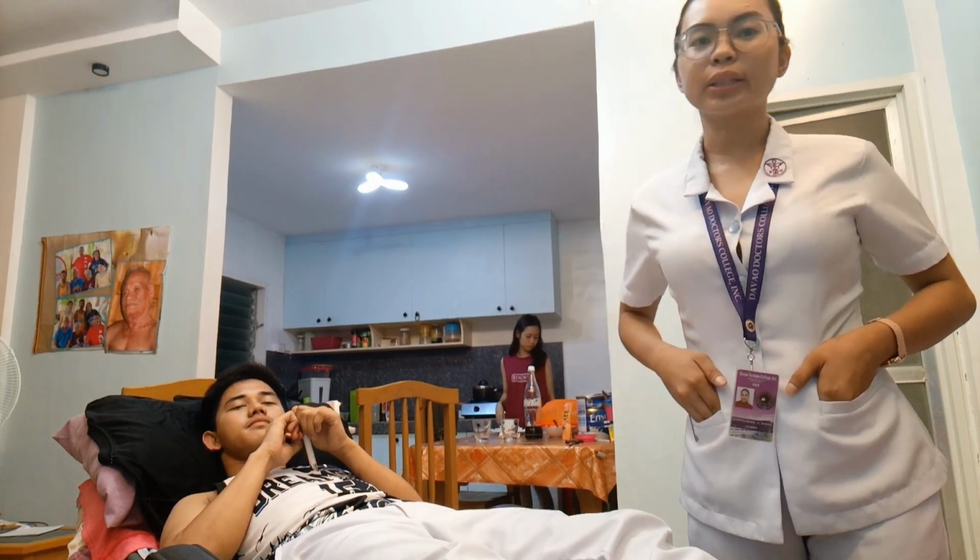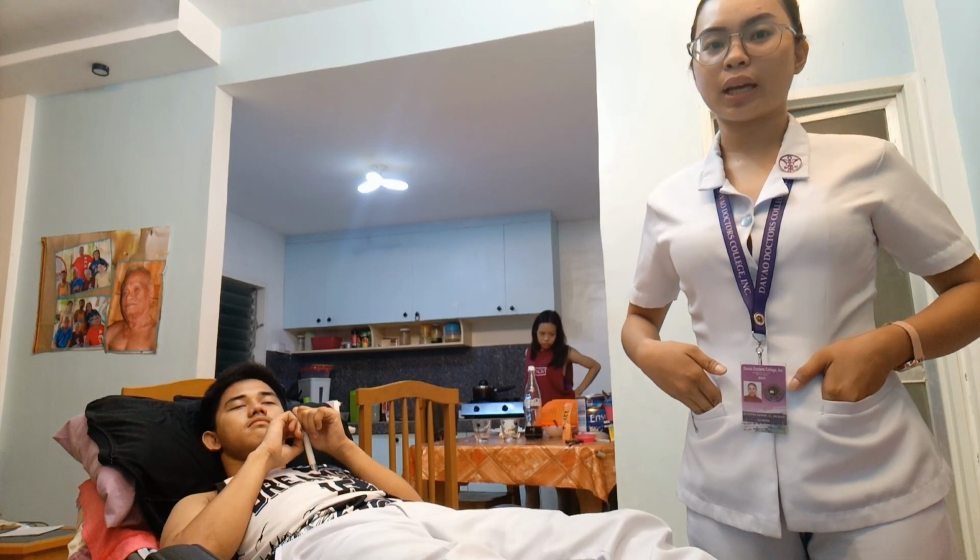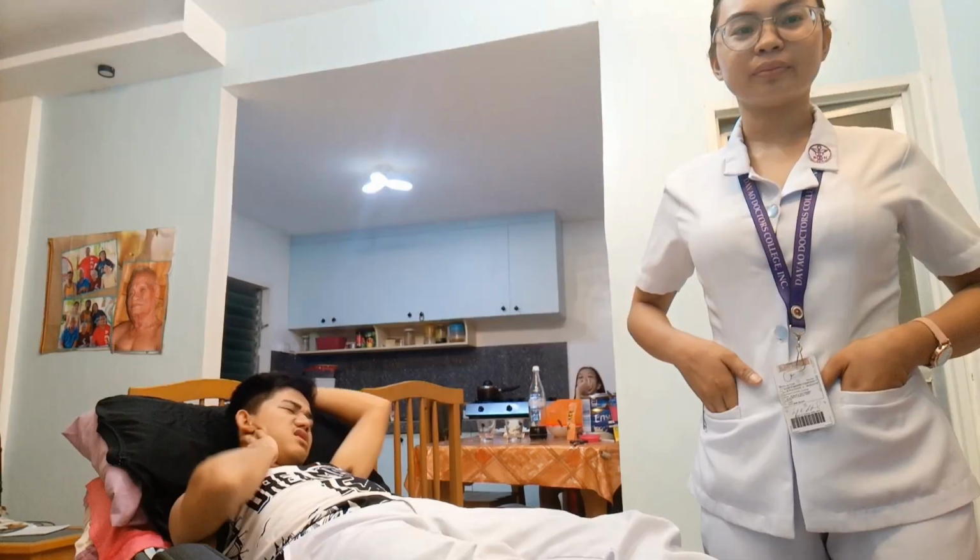Turn the client's head slightly away from the side being examined. Place the bell of the stethoscope over the carotid artery and ask the client to hold her breath for a moment and auscultate the carotid.